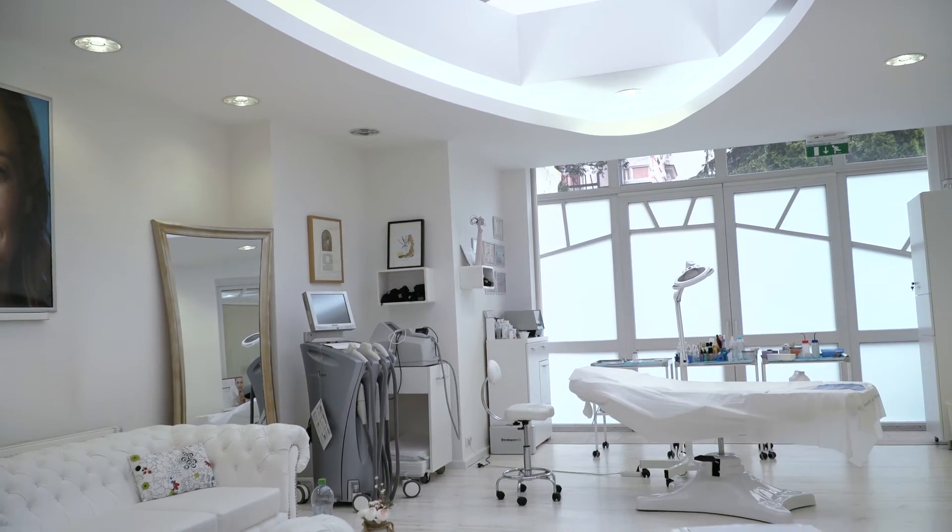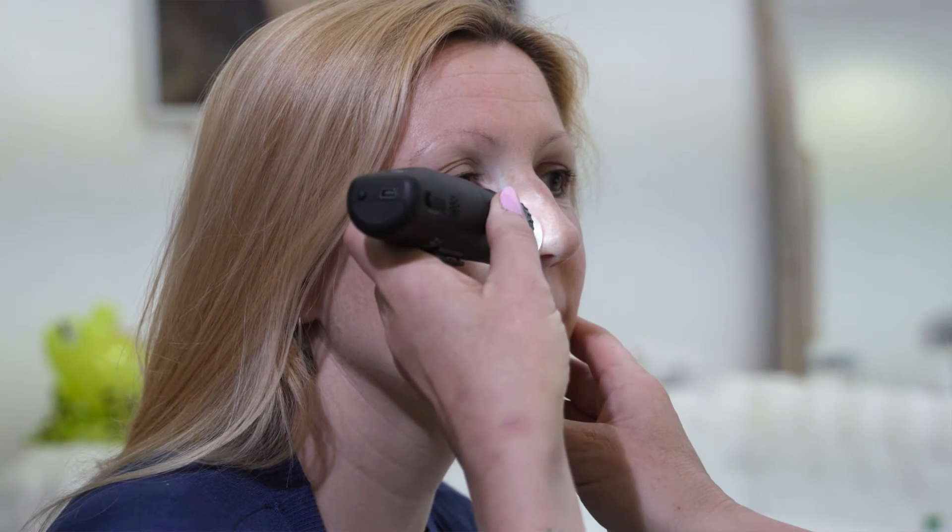The patient came to remove some skin growth from her face and body. For differential diagnosis, we have to use a dermatoscope first.